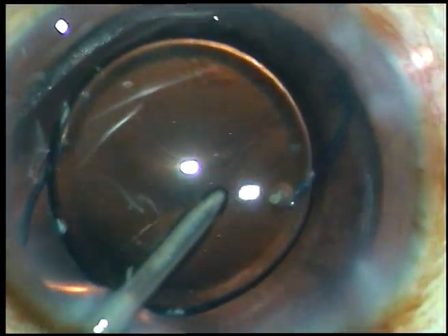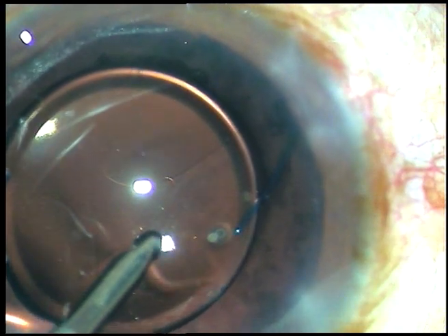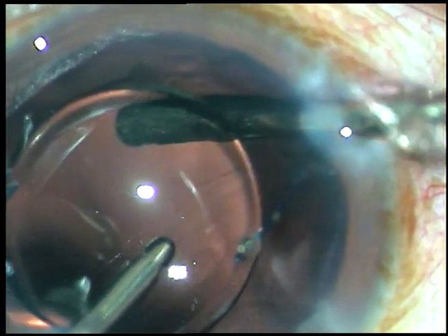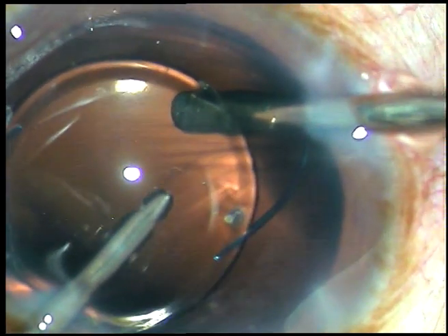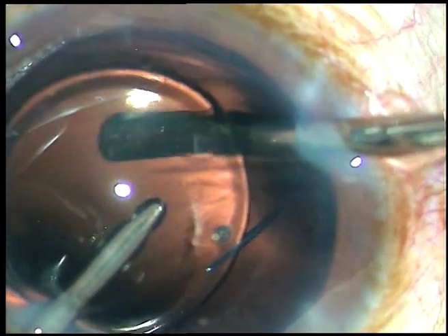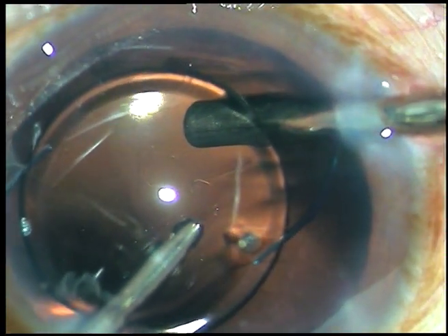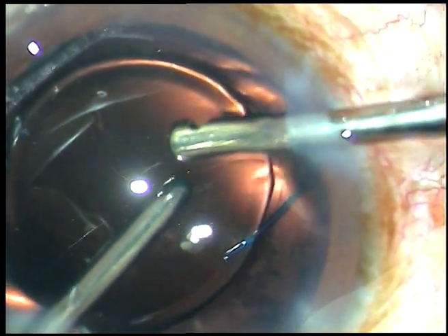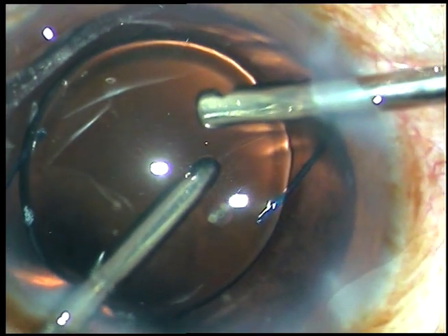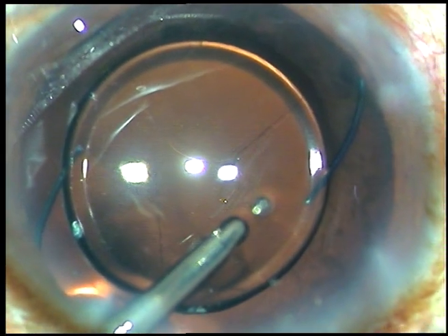A lot of viscoelastic substance has come out and the anterior vitreous has been removed adjacent to the rent area. I do some more vitrectomy. This is a two-dimensional video, so one cannot appreciate the depth of the cutting port — it is about three to four millimeters behind the posterior capsule. I am sure that there are no vitreous strands in the anterior chamber.